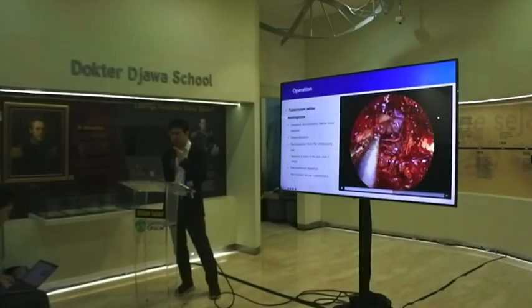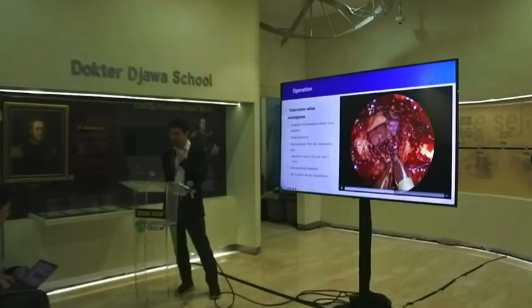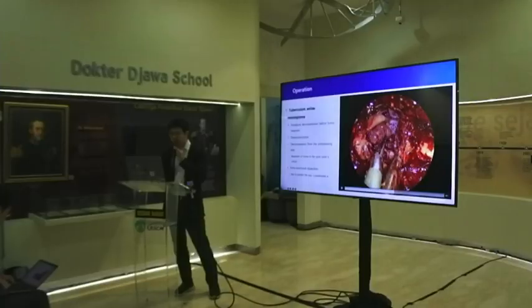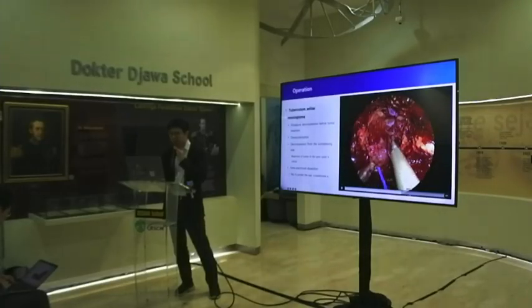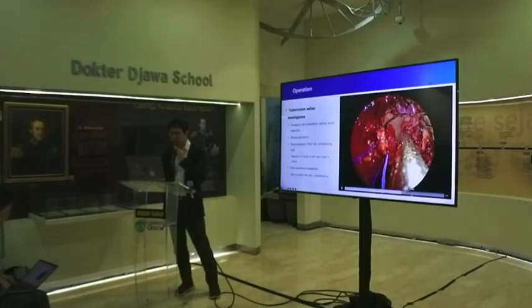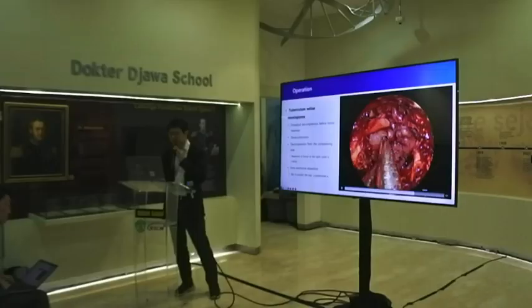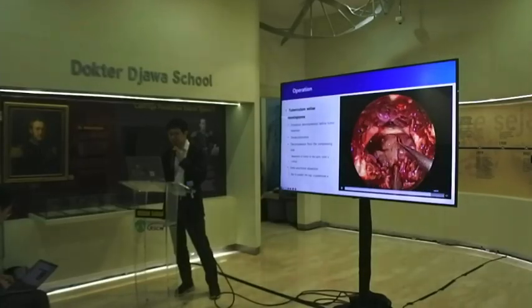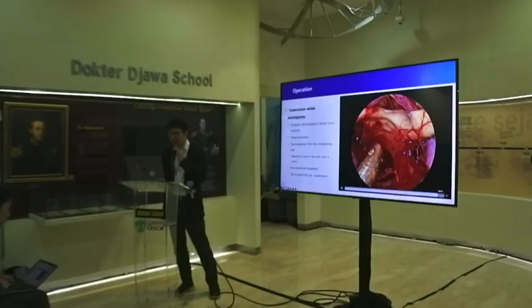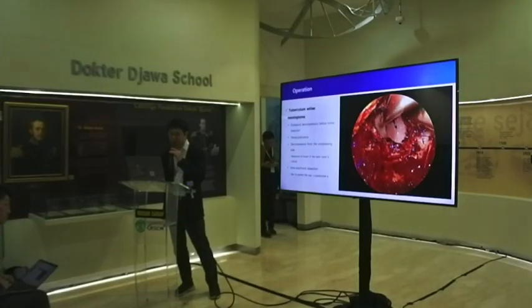By doing that, you can easily dissect the tumor from the important neurovascular structures. Yes, like this, you can dissect the tumor by extracapsular dissection, like this. So this is the final view of our surgical clip.